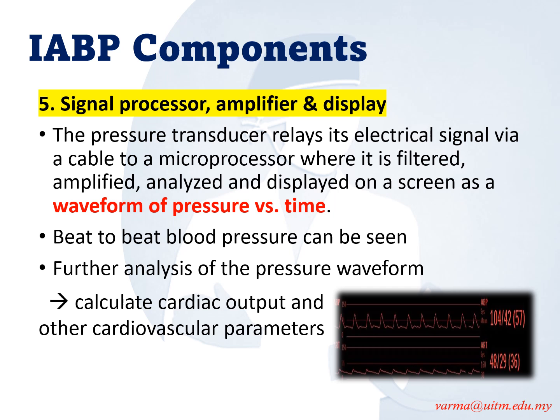In this time, there is an analysis going on called Fourier analysis, which I'm not talking about in detail here, in which it filters multiple waveforms and shows us the one waveform that we see in the monitor. It gives us a beat-to-beat blood pressure that can be seen.